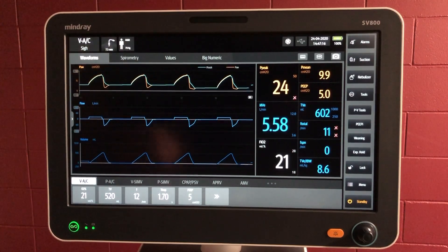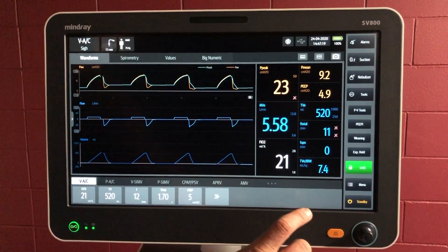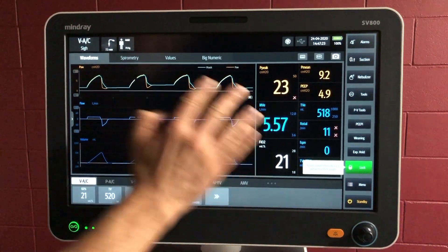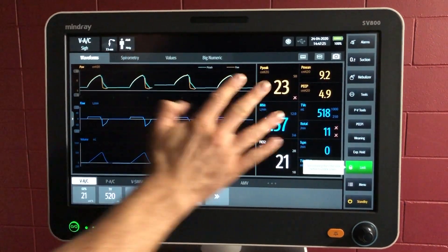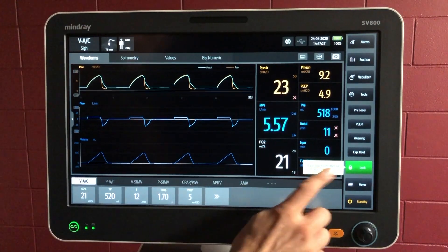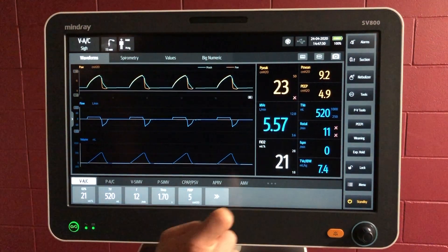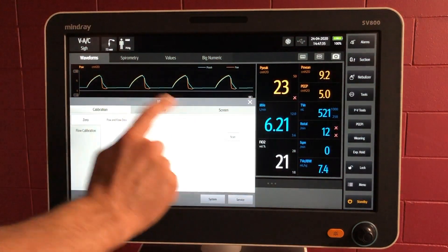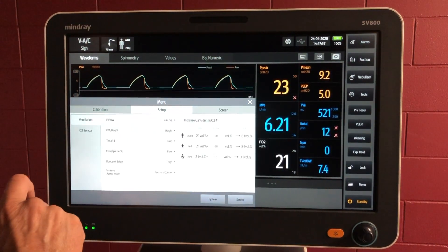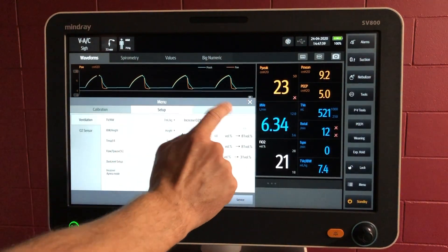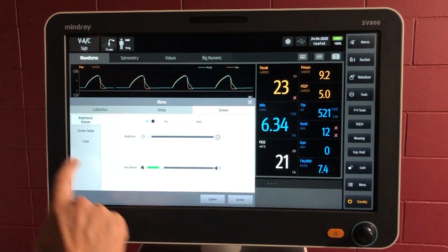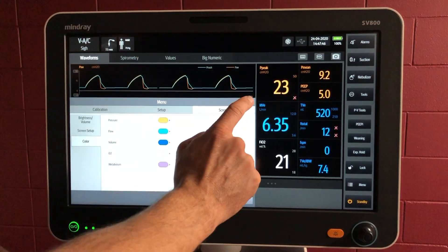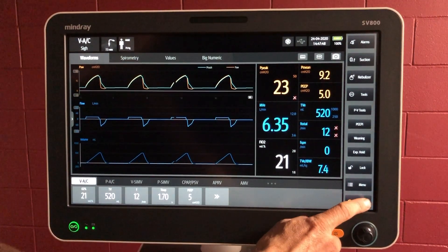If you're wanting to clean the screen, this lock button is pretty handy. It'll mean that the screen is locked and you can't make any adjustments, which is great for cleaning. You unlock it just by pushing that button again. Here's the menu button, which allows you to do some basic setup and testing. You can change the screen brightness, setups, and colours.